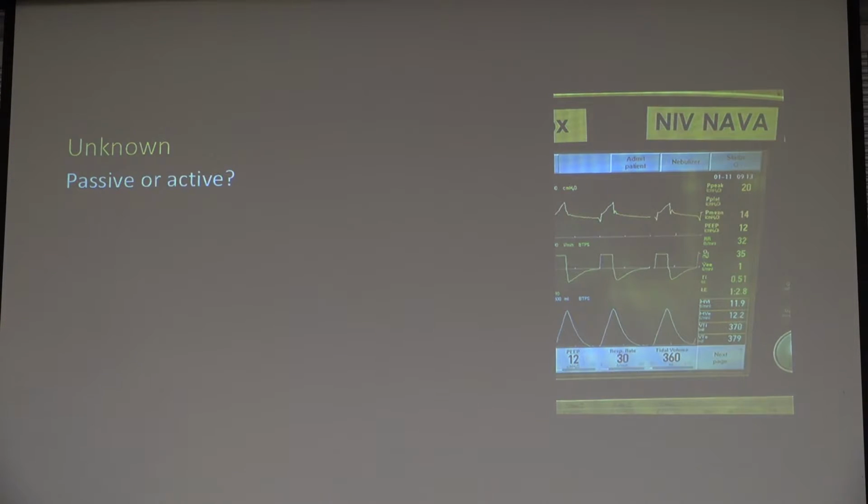And again, if I give you more information, it's a lot more obvious because you see that pink bar that says this is a patient-initiated breath. But you all are a lot more savvy than that and recognize that this pressure tracing is not normal. So we don't have a linear or shark fin shape to that, but there's irregularity or scalloped border to that. And that's an example of flow asynchrony.